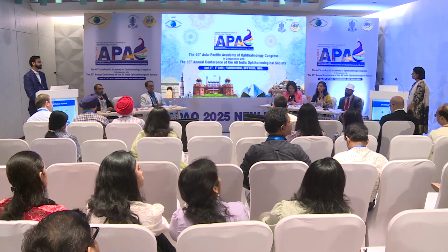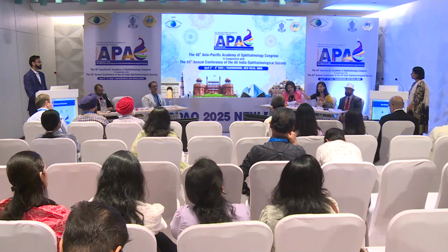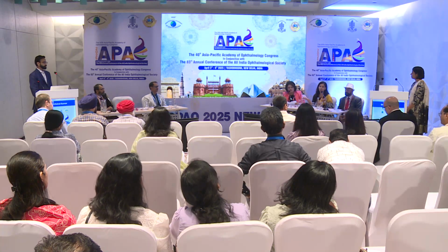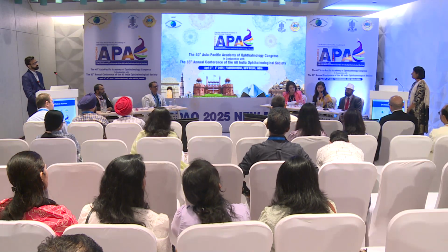It is our job to give them all the options, but also give them a perspective on the different options. The conclusion slides of both were great, because you summed up where you want to do what. And definitely anything which is a more moderate to advanced keratoconus with highly irregular cornea, irregular astigmatism, highly aberrated cornea are not cases where you want to put in a toric IOL, just because their outcomes may not be optimal. And you cannot really promise them an outcome, there may be a variation in what outcome you expect. Costing, you have to keep in mind, scleral lenses are sometimes more expensive than the cataract surgery itself. So again, if you're counseling for a contact lens, you have to explain that cost to them as well. But I think overall, great presentations from both.